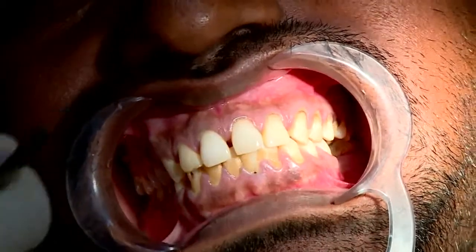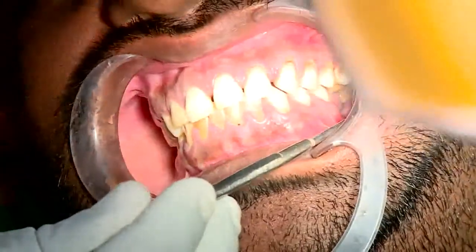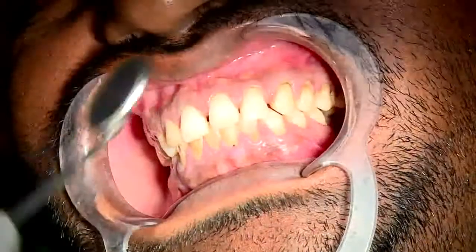This gentleman has just been numbed up. He went through an antiseptic mouthwash just to make sure that his oral preparation is slightly better.